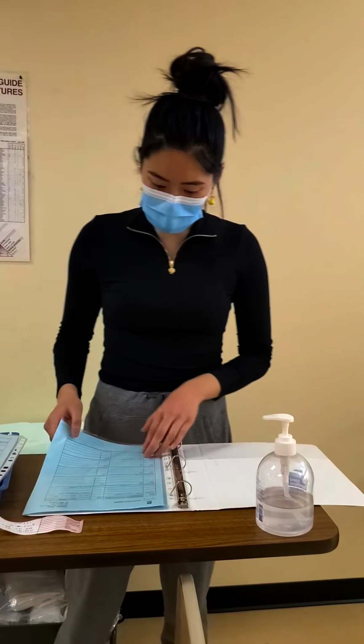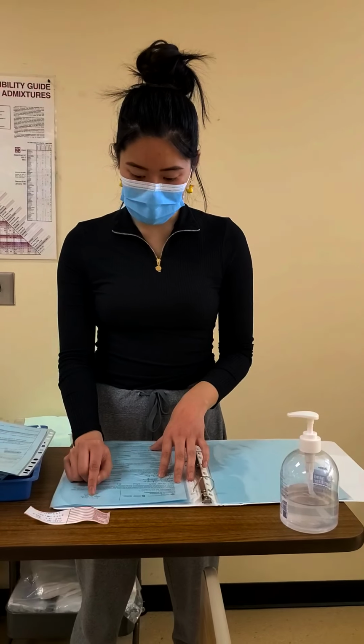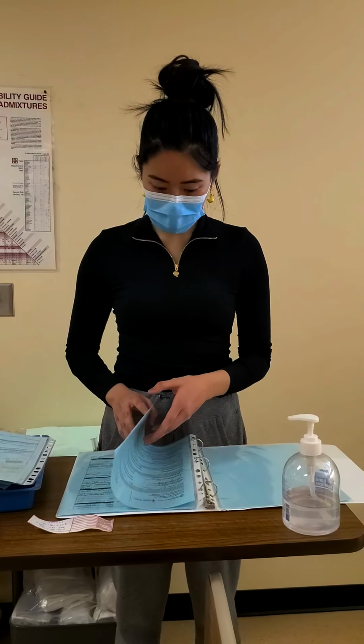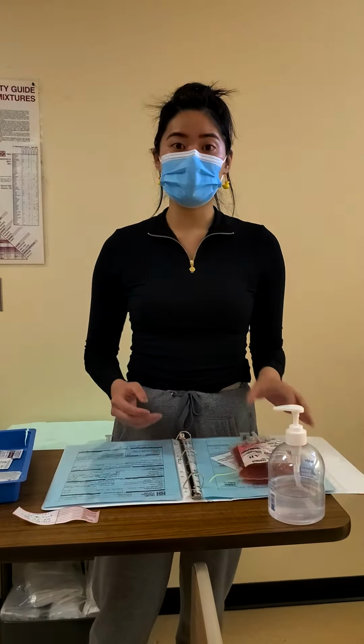Okay, so now that we have that, we're going to take a look for consent. So we have the right patient here, Atrique Jerry, VIN number 261-824-375. And it is signed by our patient and it's current, so we are able to transfuse the blood. Okay, knowing that, I would send a requisition down, which I have, and I got my record of transfusion and my blood bag and blood tag sent out here. So now at this point I would grab a second nurse so she can do my check with me.